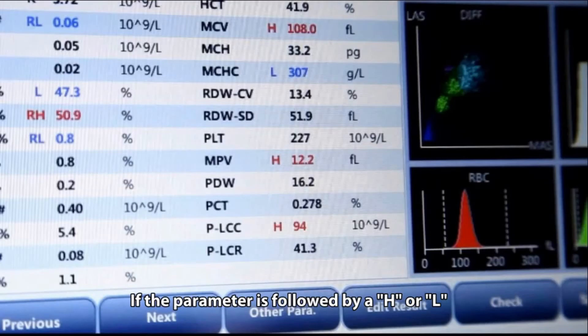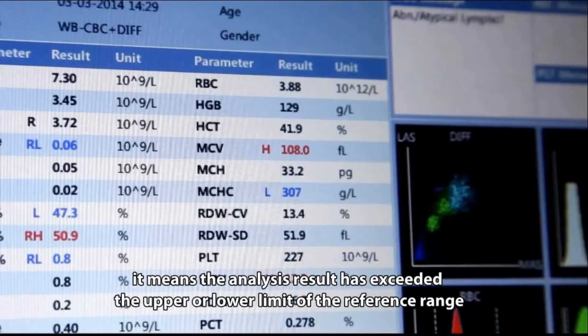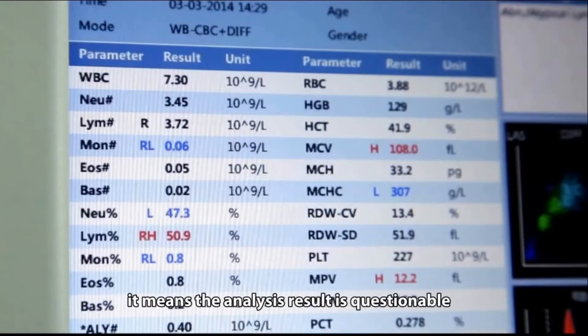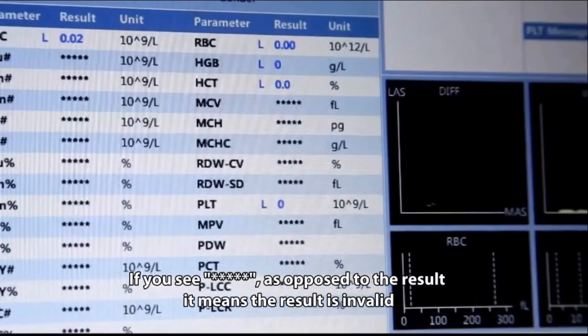If a parameter is followed by an H or L, it means the analysis result has exceeded the upper or lower limit of the reference range. If the parameter is followed by an R, it means the analysis result is questionable. If you see six asterisks (******) next to a result, it means the result is invalid.